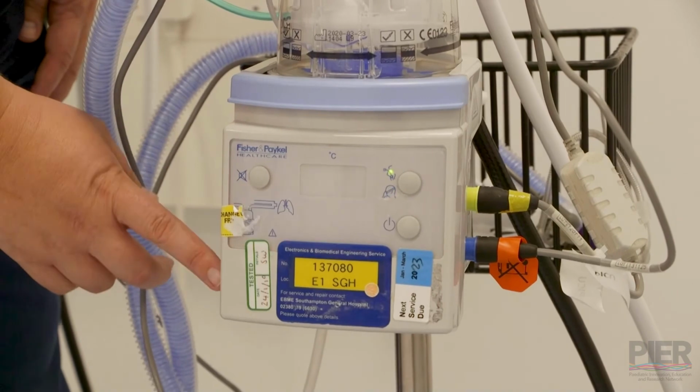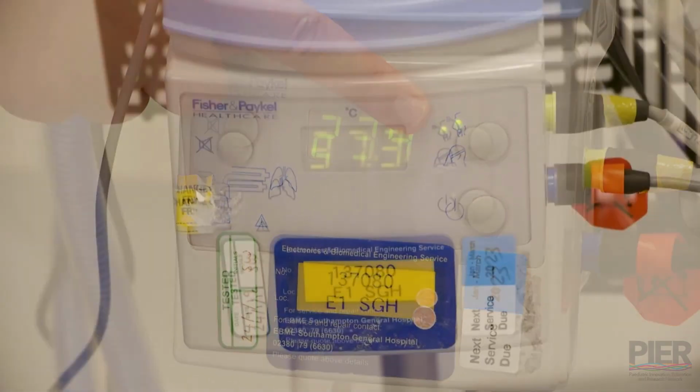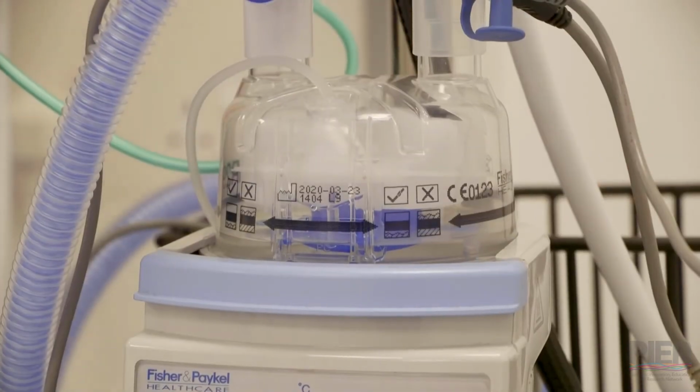When you turn on the humidifier, please make sure that it's set to the invasive mode. This will make sure that the temperature goes to 37 degrees, which is what it should be for Optiflow humidification.